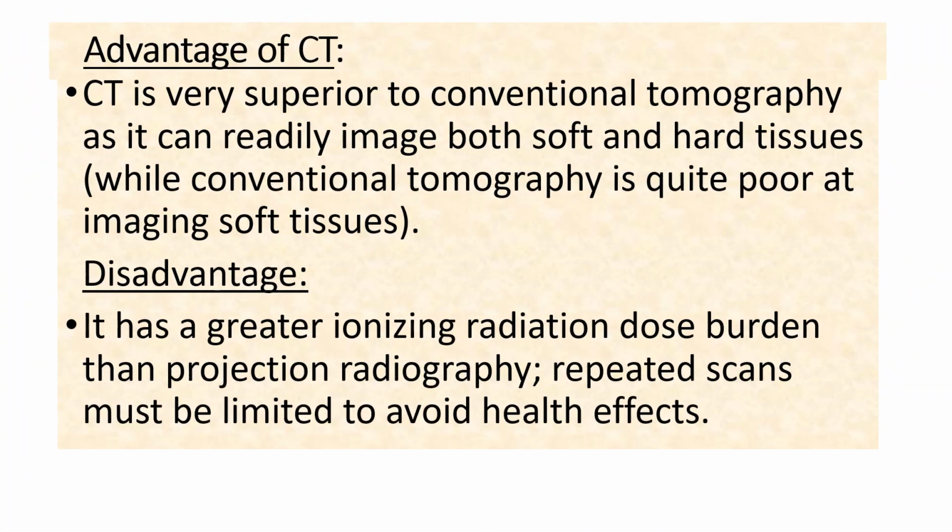What are the advantages of CT? It is very superior to conventional tomography as it can readily image both soft and hard tissues. One of the disadvantages is a greater ionizing radiation dose burden than projection radiography, for which repeated scans must be limited to avoid health effects.